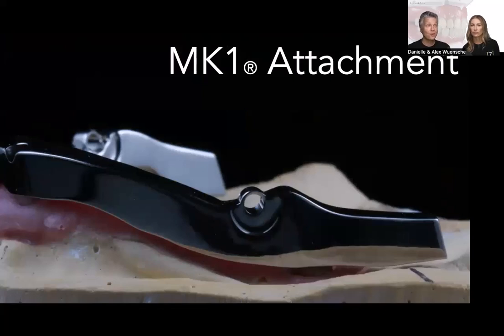Important is that the bar has to be fabricated not before the teeth are tried in. Why? Because we need to know where in space we can go with the bar, according to the position of the teeth. Exactly, because the bar is made to the teeth, not the teeth to the bar, right? So that's very important. If we're creating a bar, guessing where the bar or the teeth should be, and the bar is in the wrong position, the whole case is a failure.